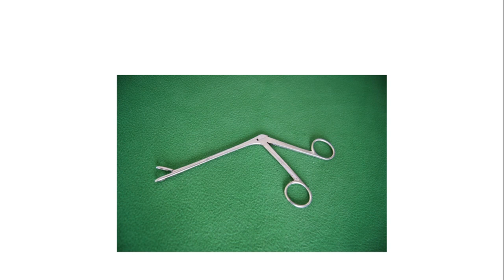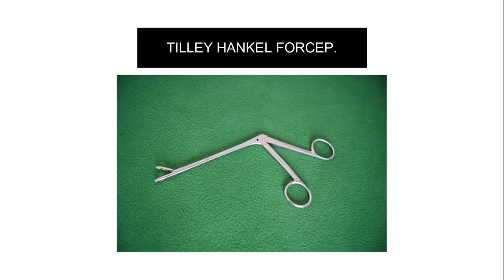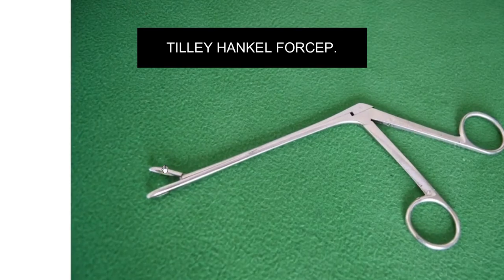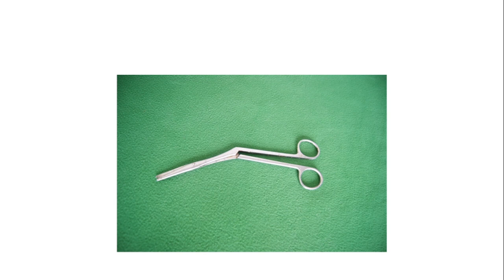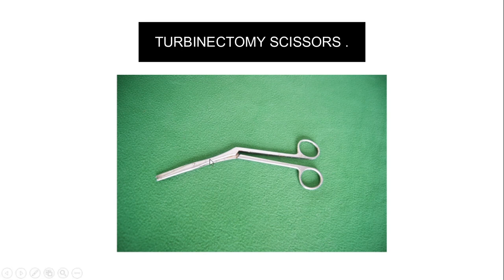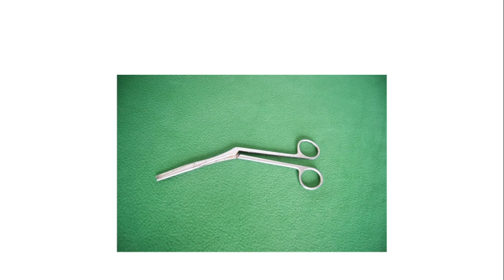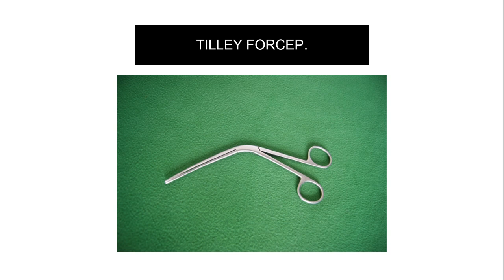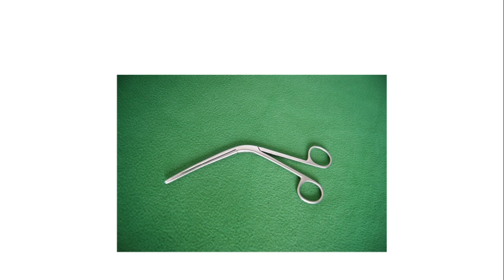This is the Tilly's Henkel forceps. This is the turbinectomy scissors, used in turbinectomy when the turbinates are enlarged — hypertrophy or hypertrophic rhinitis. This is the Tilly's dressing forceps, which is mainly used in nasal dressing, nasal packing and removal of nasal packing, and also in ear packing.